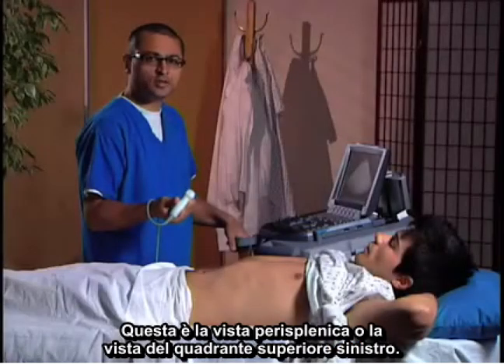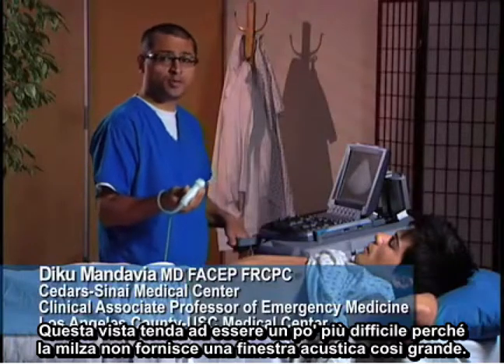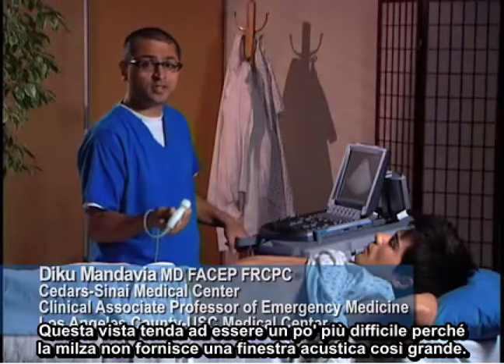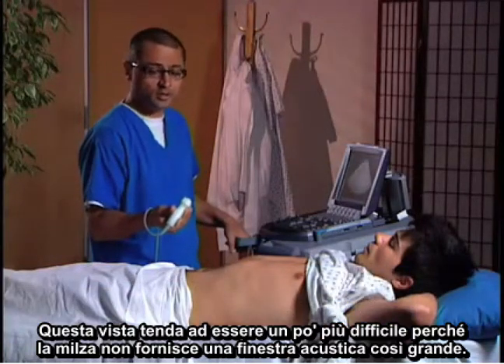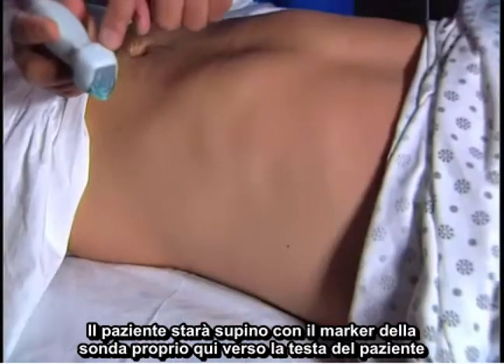The next view I'm going to take you through is a perisplenic or left upper quadrant view. This view tends to be a little bit more difficult because the spleen is smaller and doesn't provide as large an acoustic window. We're going to start again, the patient's going to be supine. This is the probe marker right here.